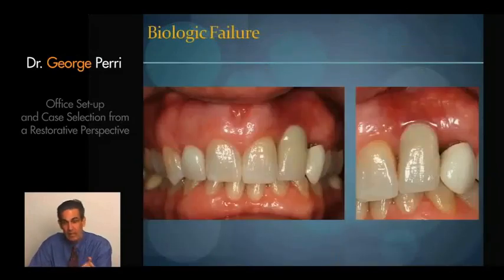We look at that case and then we turn our attention to a case like this one, which I'm sure to everyone that's done implants is the most disappointing result that we can possibly achieve. We have a relatively young patient, a nice aesthetic smile, and then one tooth. The implant retained lateral incisor is literally 3 or 4, 5 millimeters longer than it would be ideally. We have a lack of soft tissue, and then we look and we see this very red and shiny area above the implant, and that immediately implies that there's no bone there.